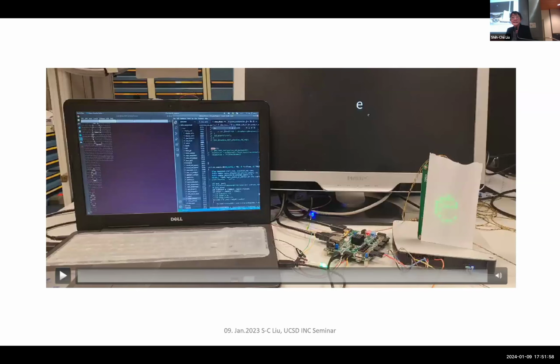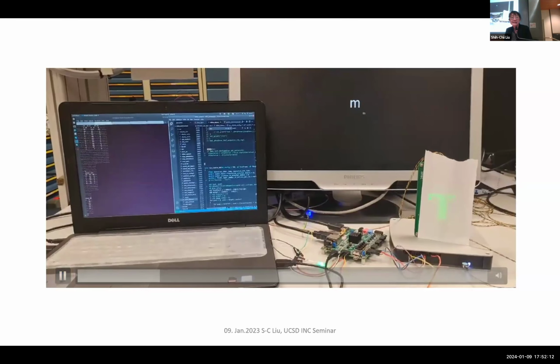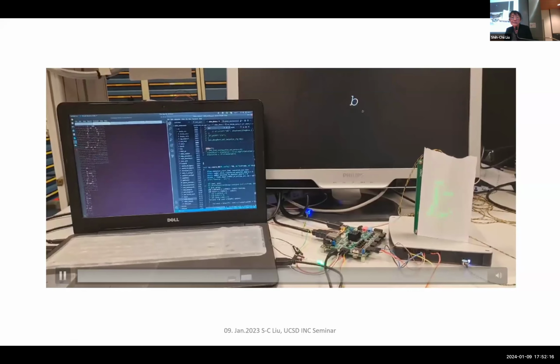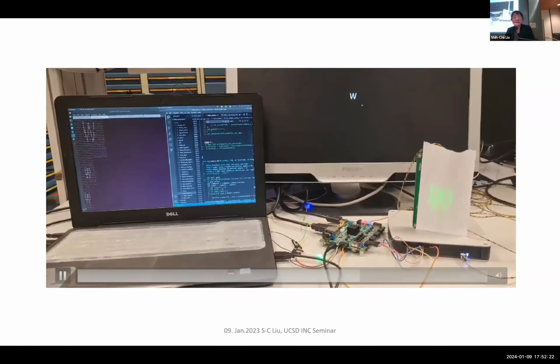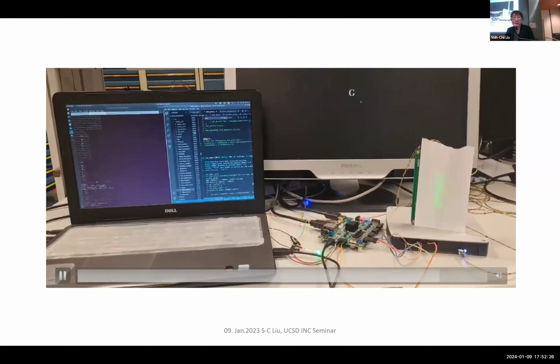And so in this case, this was actually an early experiment that we did before we had the camera going. And so the letters, or alphabet letters, are fed into the FPGA. And so here's the VPDNN, here's their box, the NeuroViper box they call it. And here's an LED display to show what the stimulation output would have looked like, right? So ideally, you can see on here, here's the input, here's the output of the phosphene network.